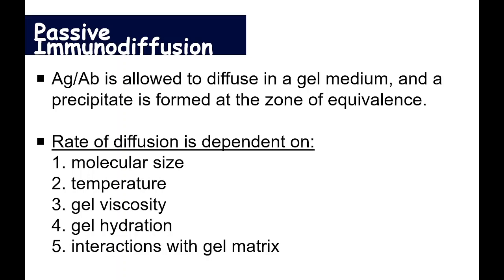And number 5, interactions with gel matrix. Keep in mind that molecules of interest may have different sizes and shapes, so we also have to consider their interaction with the gel matrix.